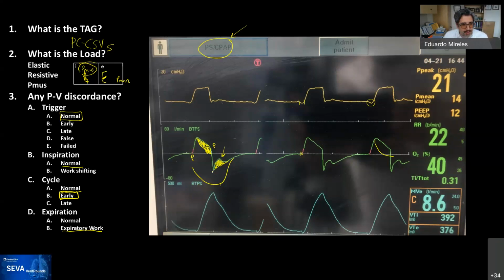Would you change anything, Marina? Yeah, you could. We're asking how to get rid of the early cycling. Is that correct? Sorry, we lost connection there for a second.